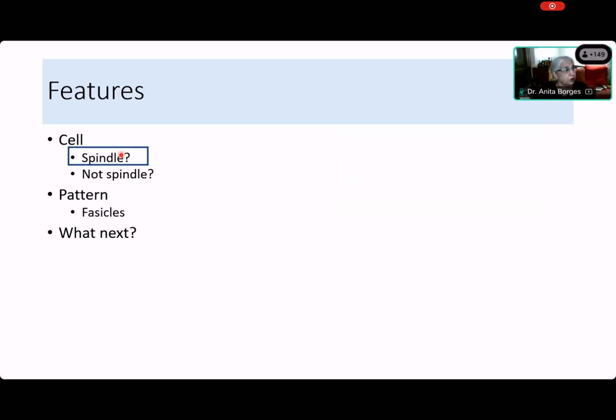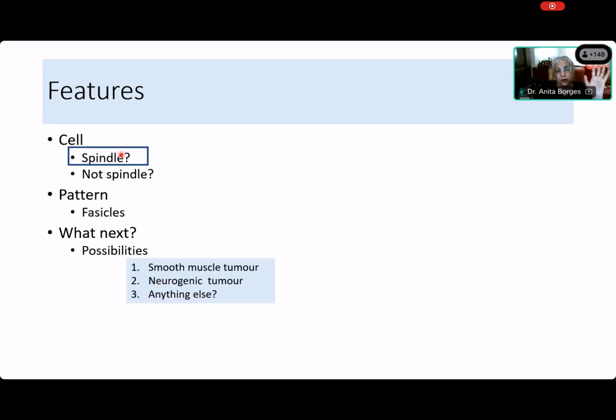All right, good. What next do you want to do? When you see fascicles and it is spindle and you have this history, and these very pink eosinophilic cells, what is coming to your mind? You have to think of some possibilities. We even said they are cigar-shaped nuclei. Smooth muscle tumor. Very good. A smooth muscle tumor is the first thing that comes to mind. Down the list would be a neurogenic tumor, because there are multiple nodules.